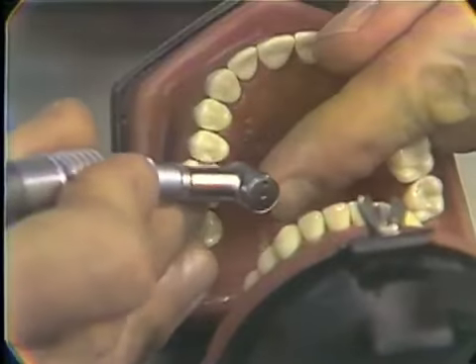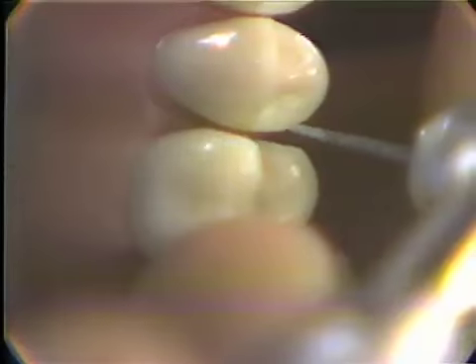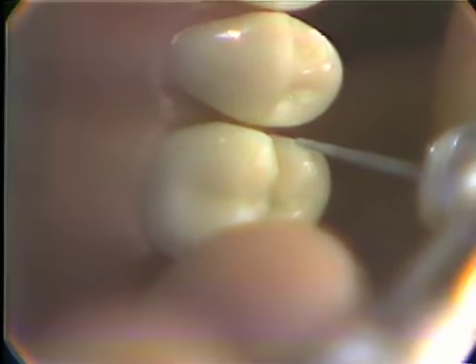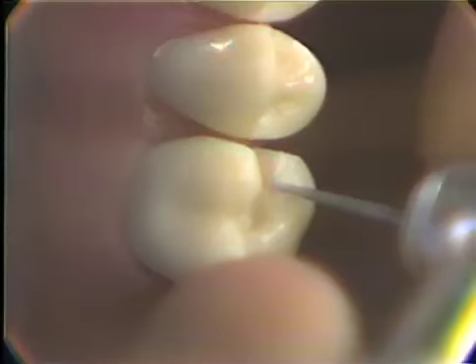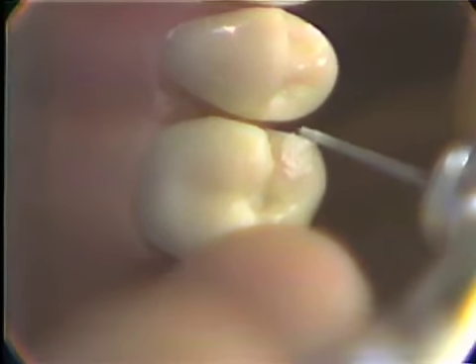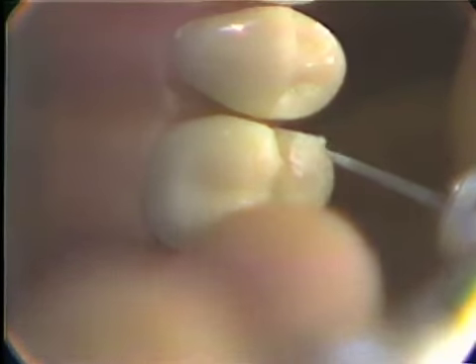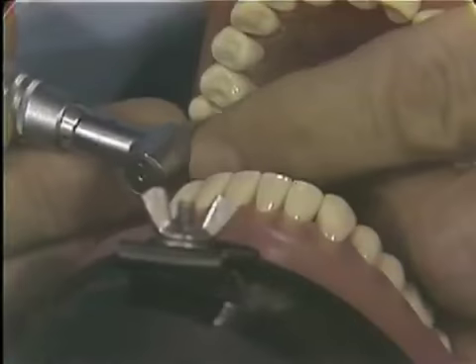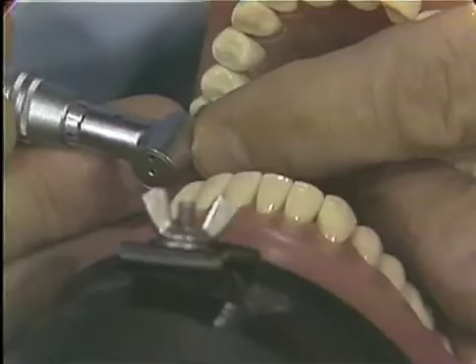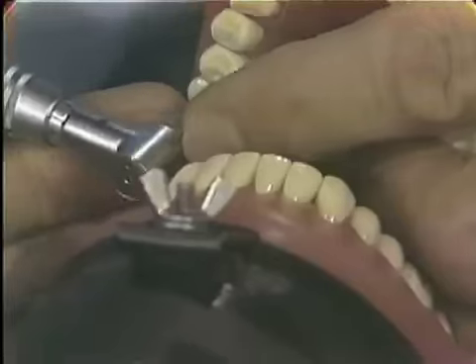From there, we will go and place our bevel on the entrant angles. Starting with the lingual entrant angle, these angles now are beveled, including a part of the slice and around onto the occlusal, as you can notice here. The diamond is cutting about 1/2 to maybe even 2/3 the depth from the occlusal to the pulpal floor. Moving then from the lingual to the buccal, you will note that we now do the same thing, starting on the slice and carrying it into the occlusal. Very important.